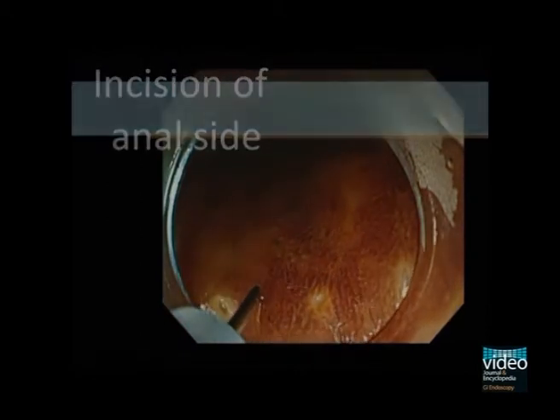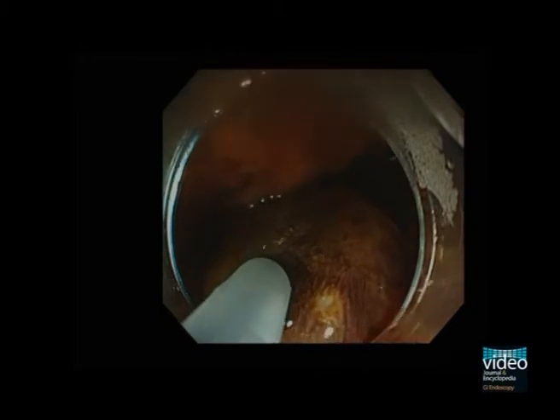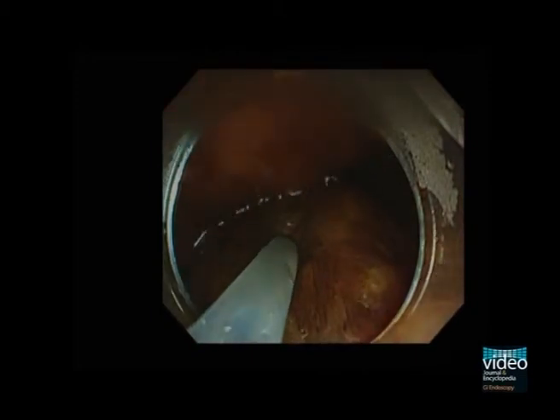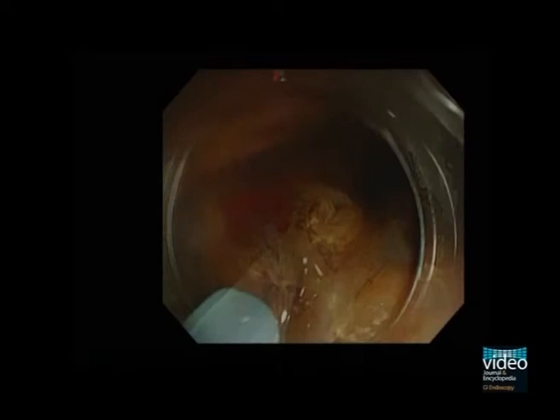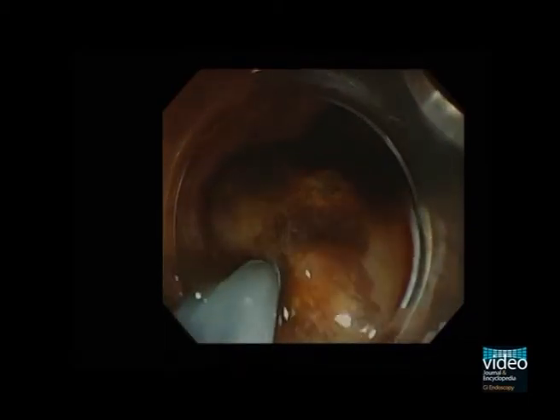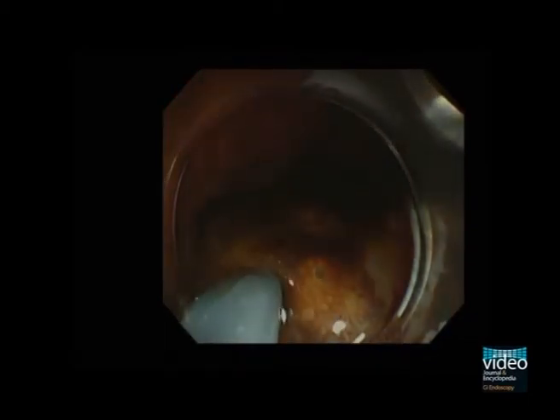We start injection from its anal side. For the first injection, we use normal saline. After proper injection to the submucosa is confirmed, we use double dilution of hyaluronic acid preparation and normal saline for additional injection, because inappropriate injection of hyaluronic acid preparation to the muscular layer or subserosa can disturb following procedures.